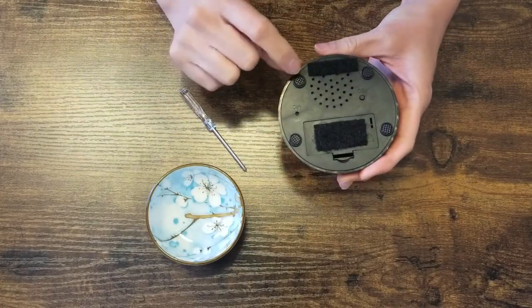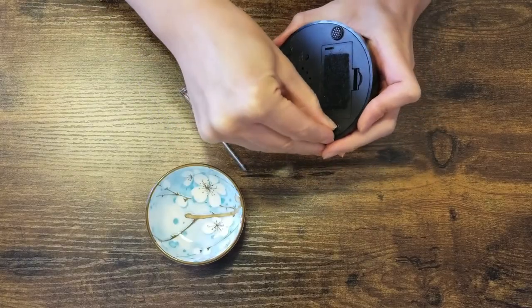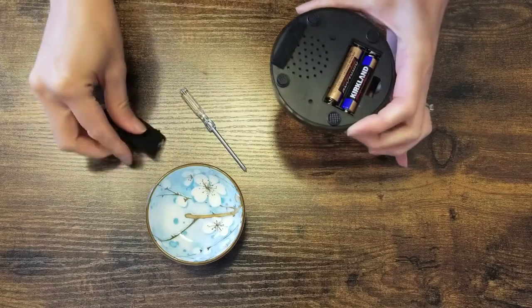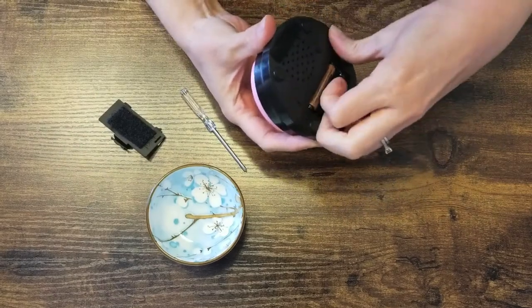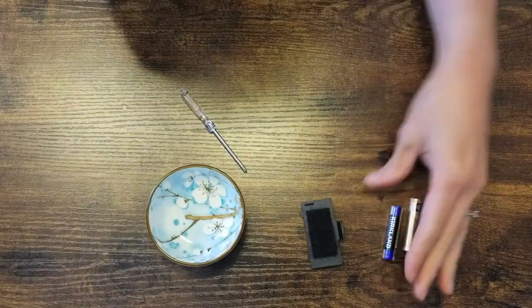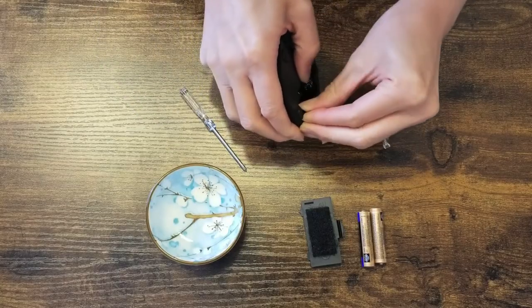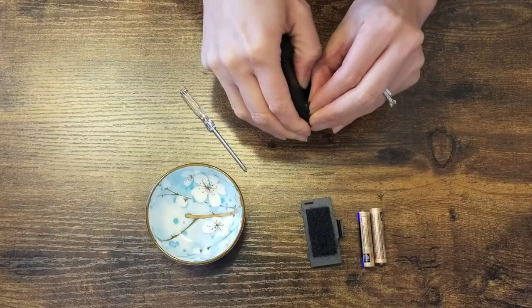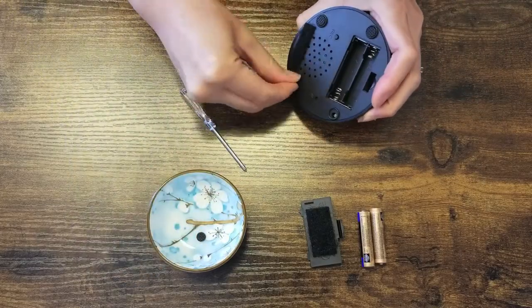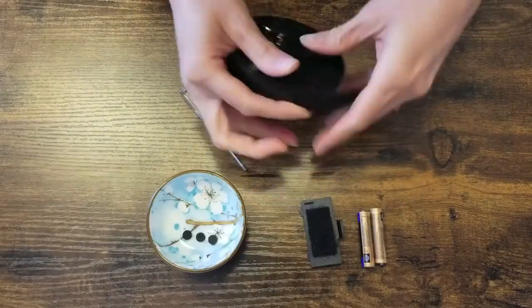Flipping it over, there are four little feet. Take off the little foot pads — I'll actually take the battery out first. So four feet, it's a little bit of effort, just pull them off. Put them in a little dish so you don't lose them. If it's really hard to get out you might use pliers, but I have fingernails and it just takes a little bit of finagling.